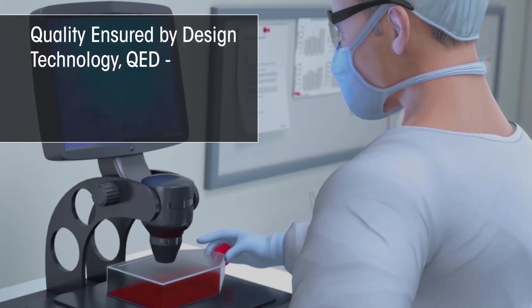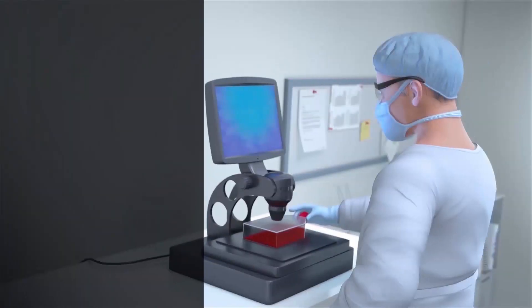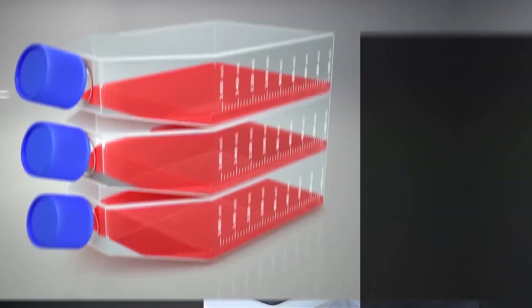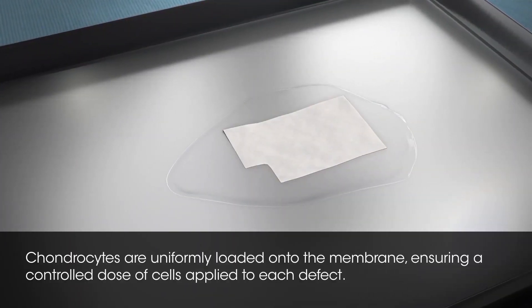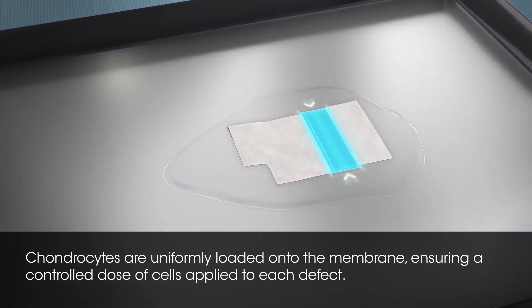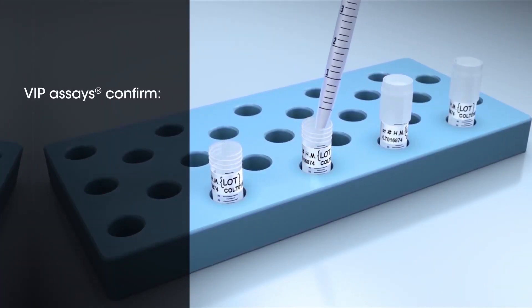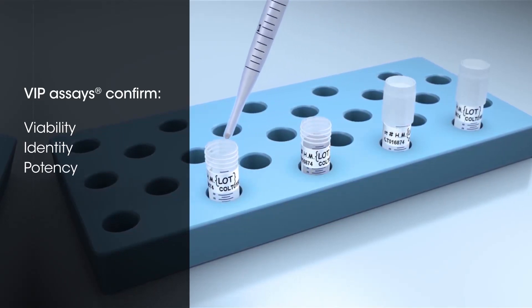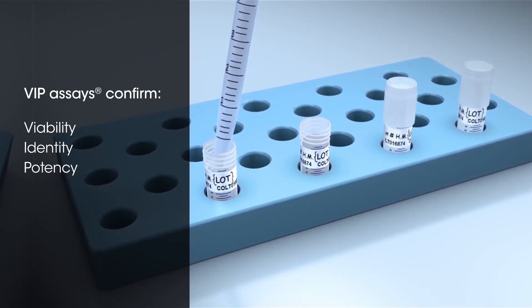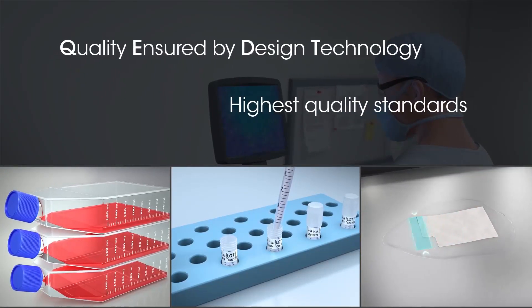Quality Ensured by Design Technology. Proprietary lab processes and expertise ensure the highest quality cells. Throughout the cell culture stage, chondrocytes are regularly examined for growth, morphology, and sterility. Lot segregation and closed culture conditions are in place to prevent cross-contamination. Once cells are expanded, they are uniformly loaded onto the membrane, ensuring a controlled dose of cells is applied to each defect. VIP assays are utilized to confirm viability, identity, and potency prior to final release. A Novel Gene Expression Assay characterizes the cells and verifies chondrogenic synthesis, making certain the highest quality standards are achieved.